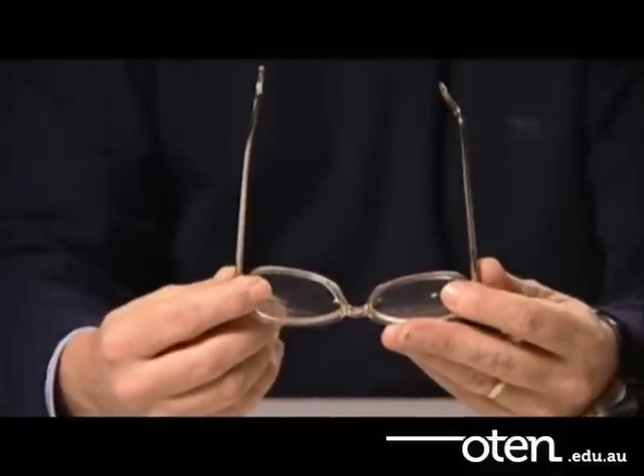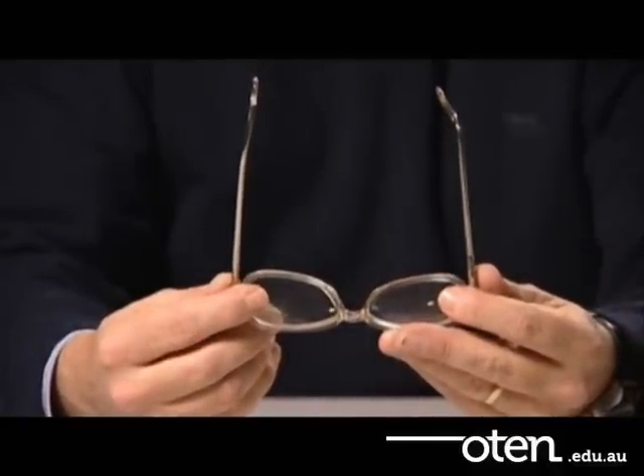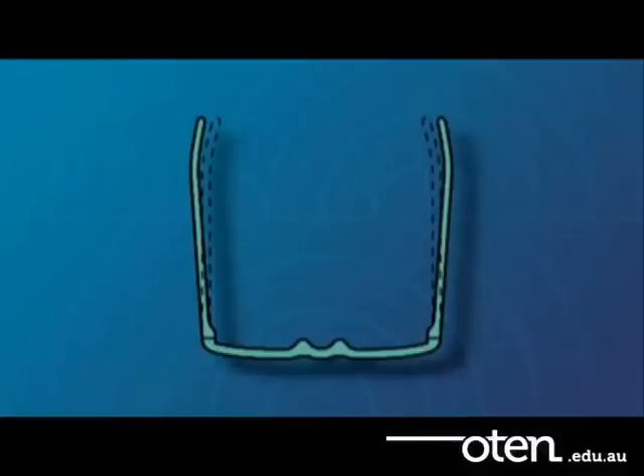Look at the angles that the fully open temples make with the frame front. These should each make an angle of about 95 degrees, or just past perpendicular to the frame front when opened. Realign the let-back angles if necessary. This is also known as temple parallelism.